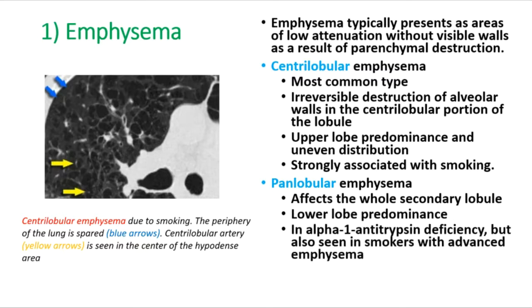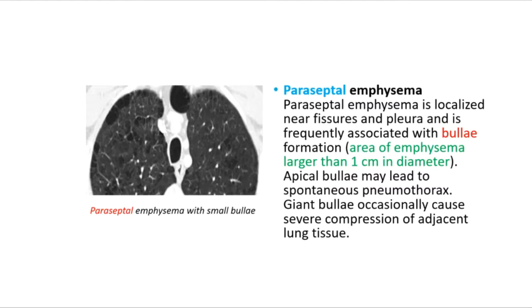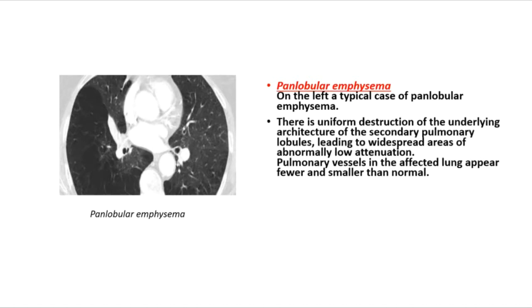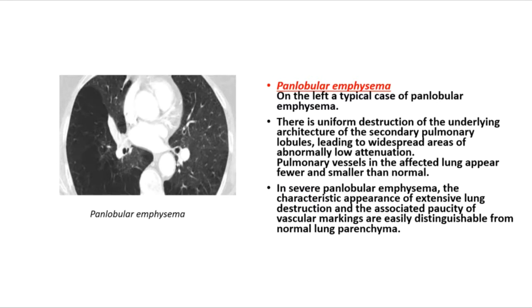Panlobular emphysema shows lower lobe predominance in alpha-1 antitrypsin deficiency, but is also seen in smokers with advanced emphysema. Paraseptal emphysema is localized near fissures and pleura, frequently associated with bulla formation; apical bullae may lead to spontaneous pneumothorax, and giant bullae can cause severe compression of adjacent lung tissue. In panlobular emphysema, there is uniform destruction of the secondary pulmonary lobule architecture, with widespread low attenuation and fewer, smaller pulmonary vessels.